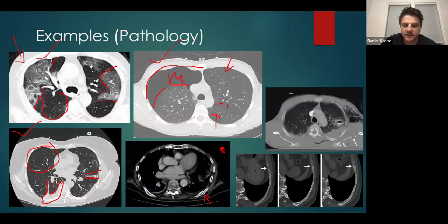I know that it's kind of difficult to describe. It's a little bit darker, it's less white, the grayscale is turned down a little bit. So it's looking at more dense things, as opposed to lung windows, which are looking at less dense things. The bones themselves are evaluated a little bit better in this window, which is why it's called the bone window.